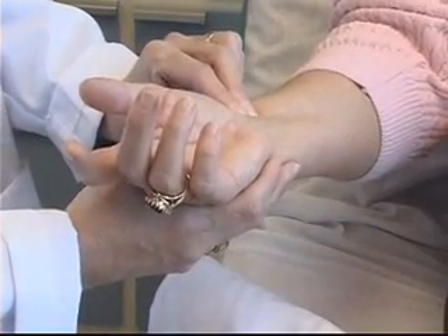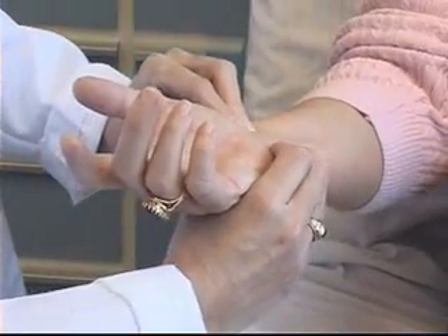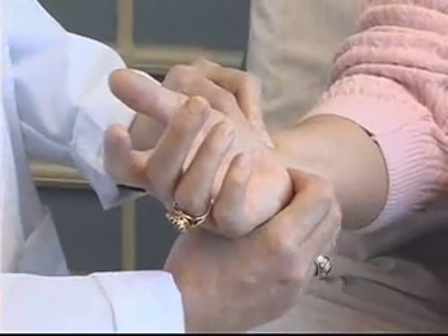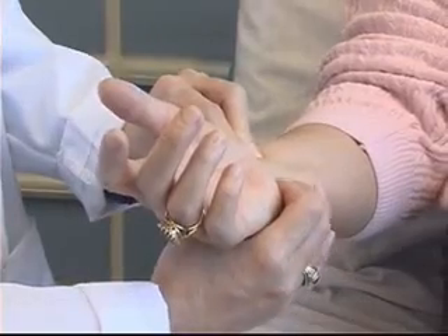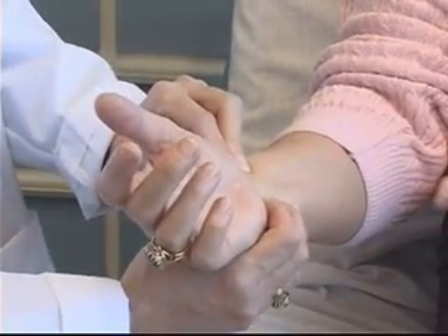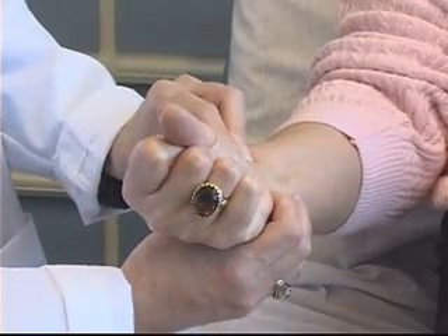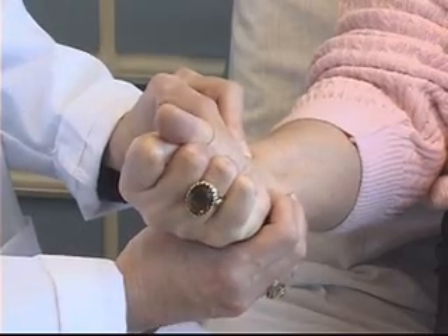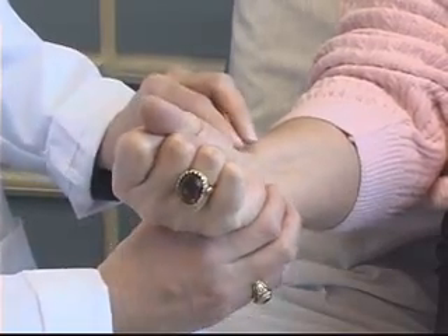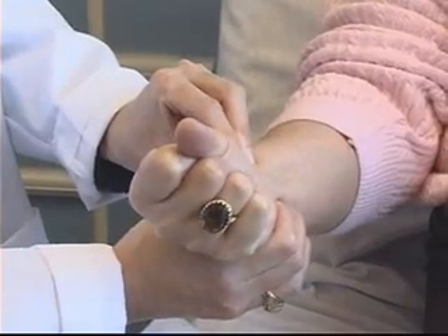The Allen's test is performed as follows. First, I'm going to palpate with my fingers the radial artery. Next, I'm going to palpate the ulnar artery. If I can't feel the ulnar artery, I'm going to palpate the area closest to where I think it would be located. I'm now going to ask my patient to make a fist as tight as she can and maintain that for approximately 10 seconds, while I occlude both the radial and the ulnar artery.